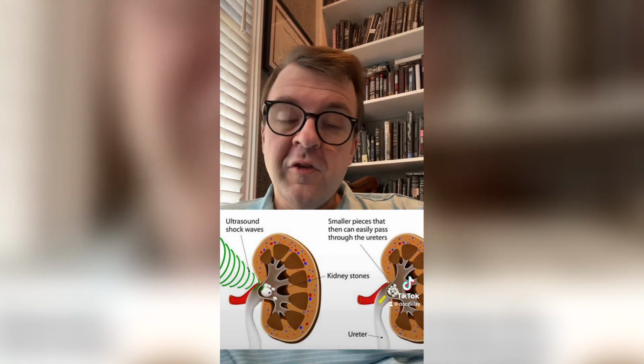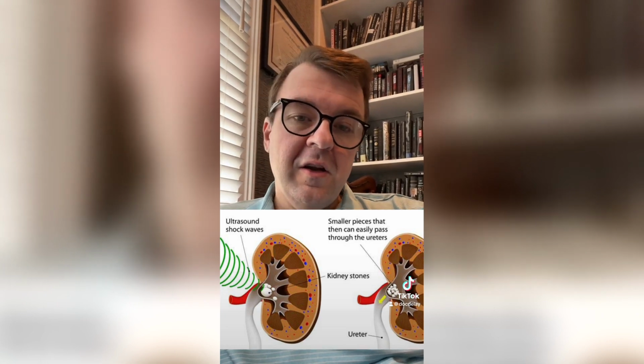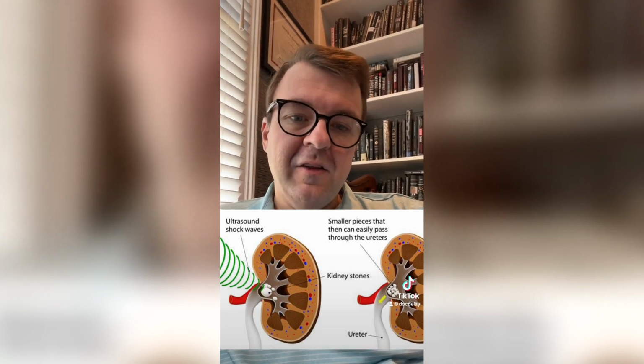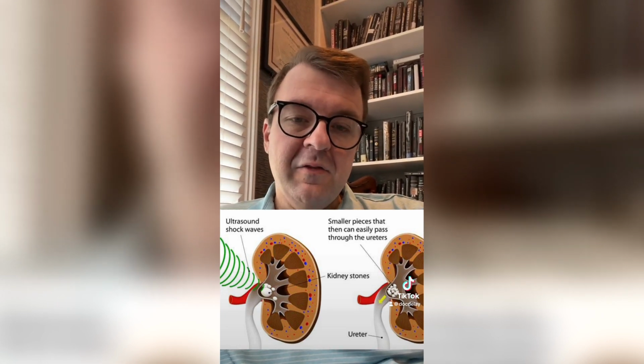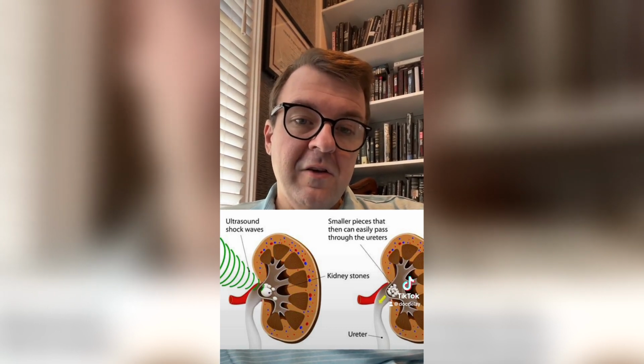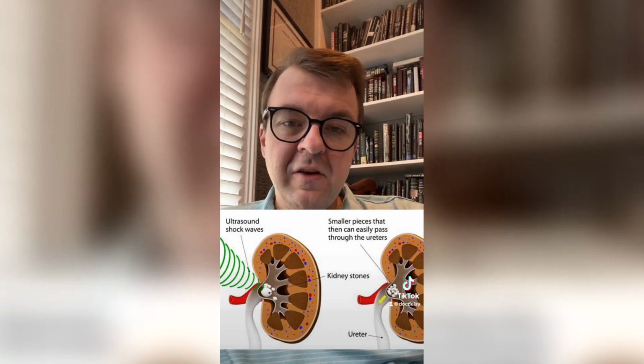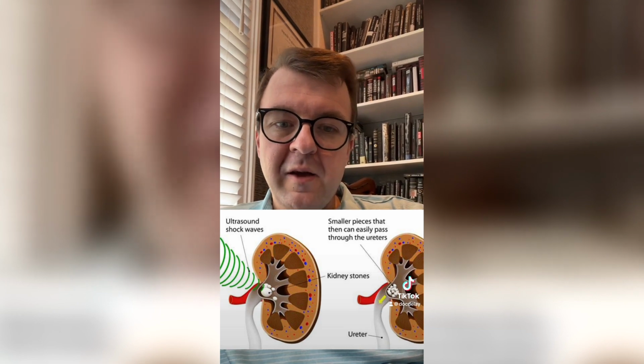Shockwave lithotripsy is a process where sound waves are used, and they are targeted towards the stone from outside of the body. There are a variety of different types of devices that have been used to do this. Now, we mainly use what's called a piezoelectric lithotripter, but the basic idea is the sound waves break up the stone into fragments that are small enough to be passed. Here, once again, the patient is usually asleep, but for most patients we don't have to place a scope inside because the stone is broken up.